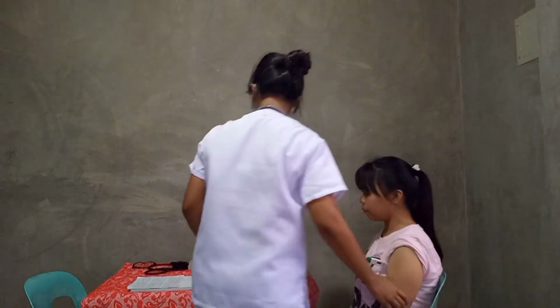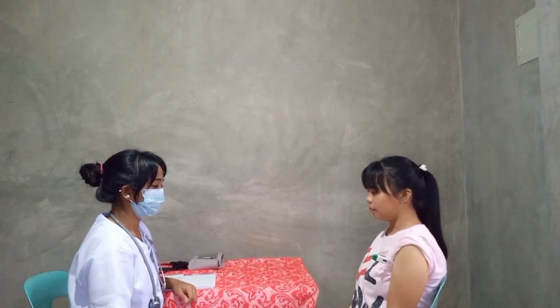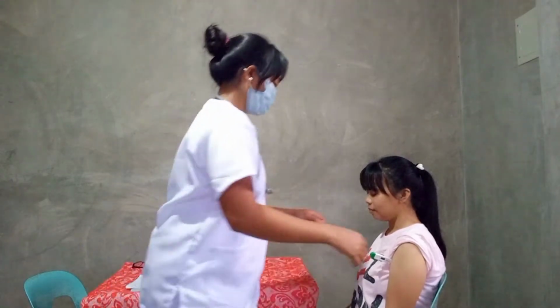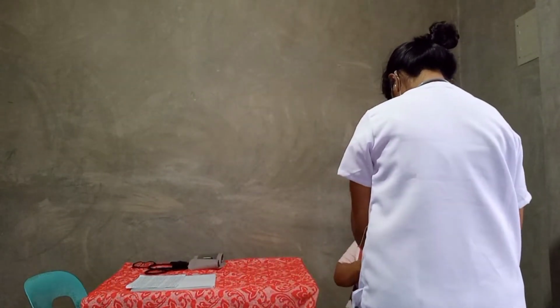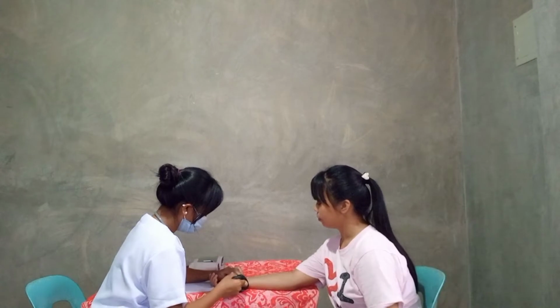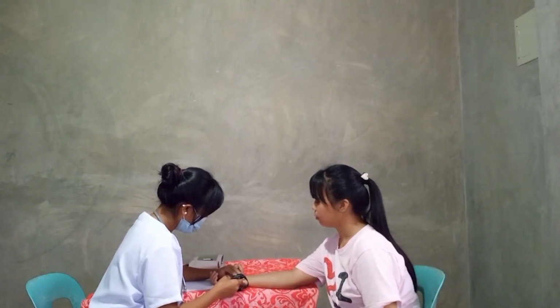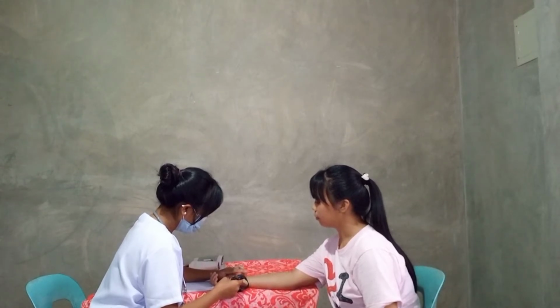Okay. And the client's temperature is 36.5, which is normal. And now we proceed to get your pulse rate. Give me a hand. And the pulse rate of the client is 88 beats per minute, which is normal as well.